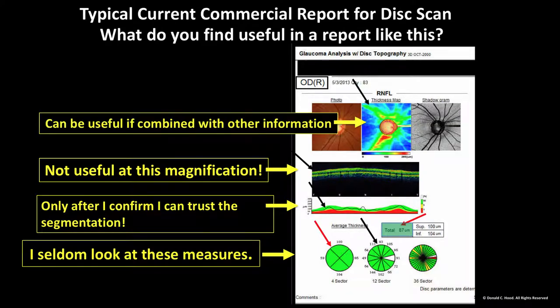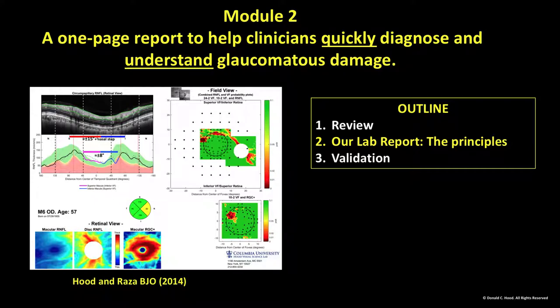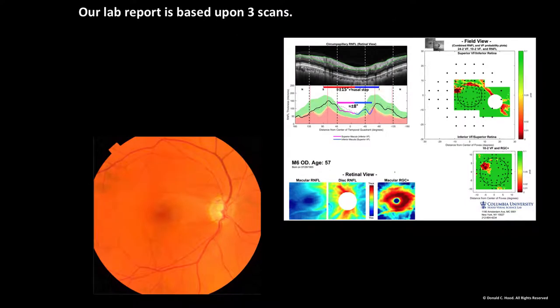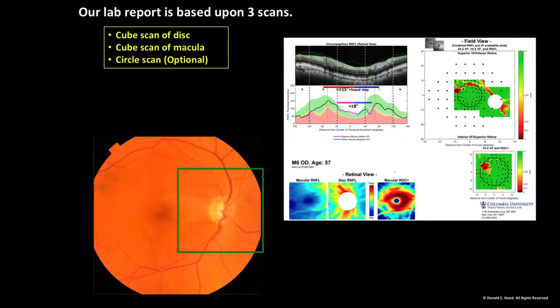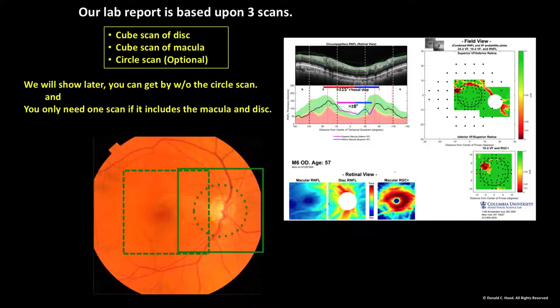So what should a report look like? Here's our answer. This is a one-page report for helping clinicians both quickly diagnose — because I think you can be much faster with this report — and also to understand the nature of damage. This report is based upon three scans: a cube scan of the disc (in the cases I'll show, these have 128 individual line scans), a cube scan of the macula, and something optional but useful — a separate circle scan of the disc. You can get by without the circle scan, and it's actually possible to get this information with just a single scan that includes both the macular and the disc.